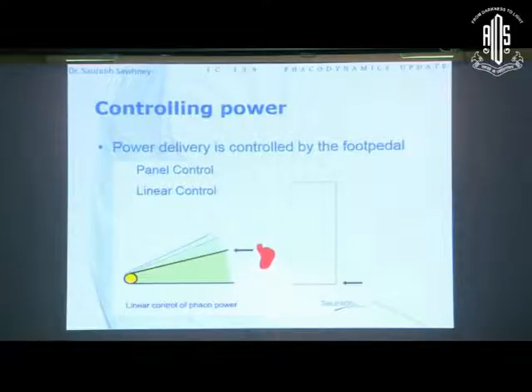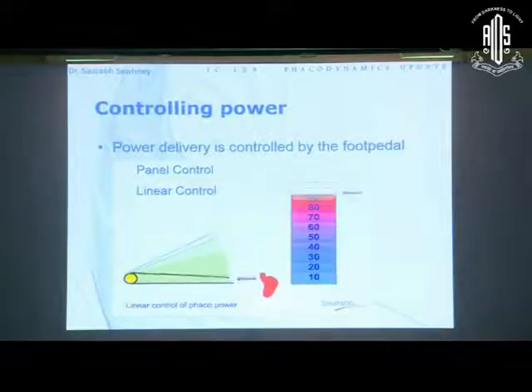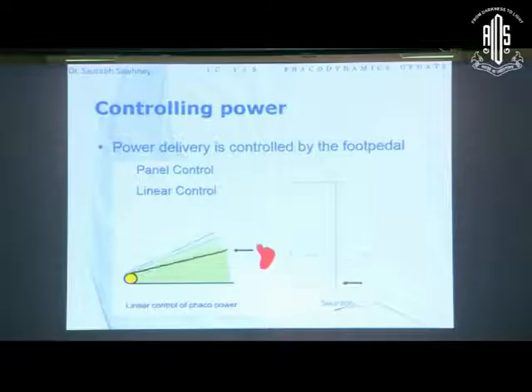Now this is a very, very useful tool for the surgeon. You can press more if you want more power, less if you want less power, and thereby minimizing the use of your energy.